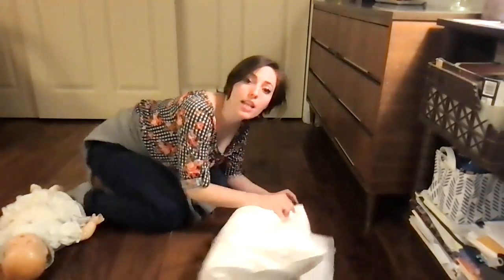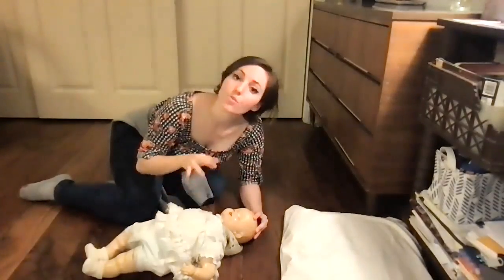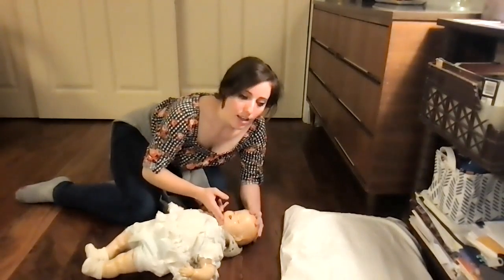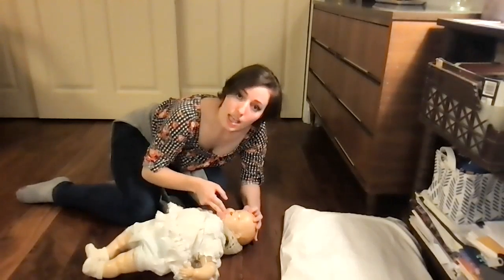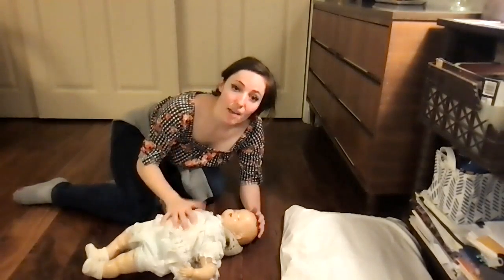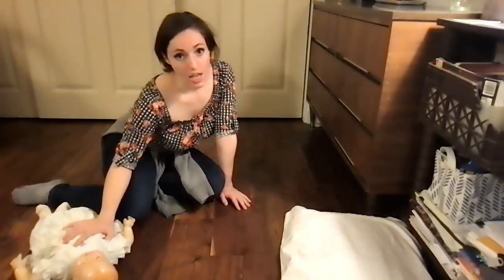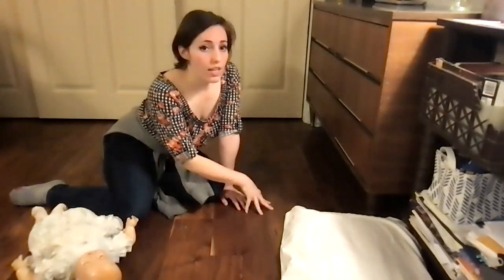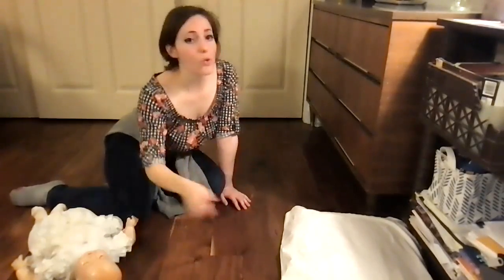If you're giving breaths and the person's chest doesn't rise or fall the first time, reposition the airway. Take a moment, take a step back, reposition the airway, tilt the head, lift the chin, and then give another breath. If it works, great. If it doesn't work the second time, maybe just go back to compressions, because they might have something blocking their airway. And then you're just going 30 compressions, 2 breaths, 30 compressions, 2 breaths. You're just doing that for a cycle.